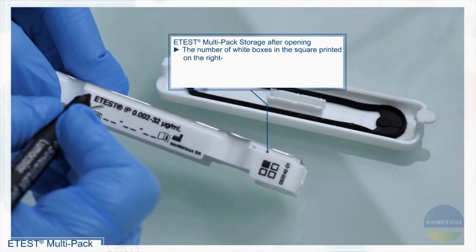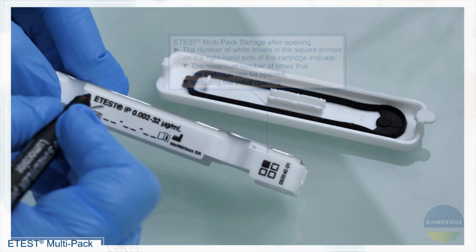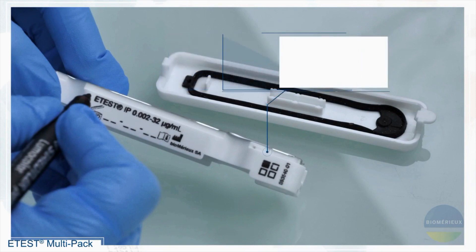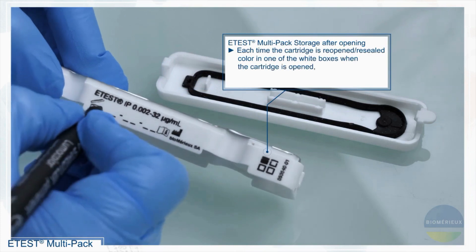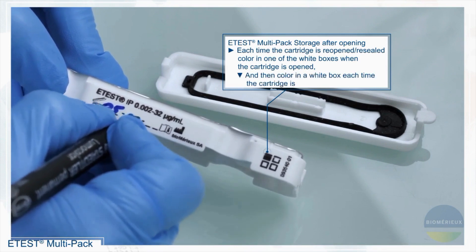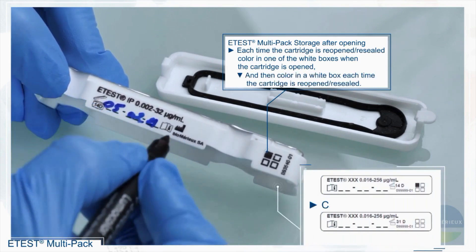The number of white boxes in the square printed on the right-hand side of the cartridge indicates the maximum number of times that the cartridge can be opened, including the initial opening. Each time the cartridge is opened or resealed, color in one of the white boxes.